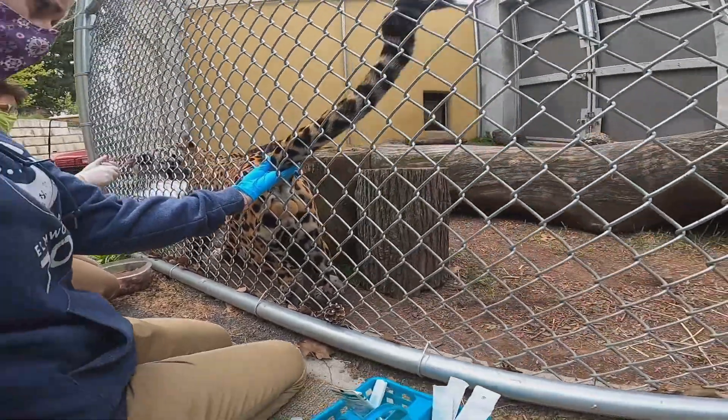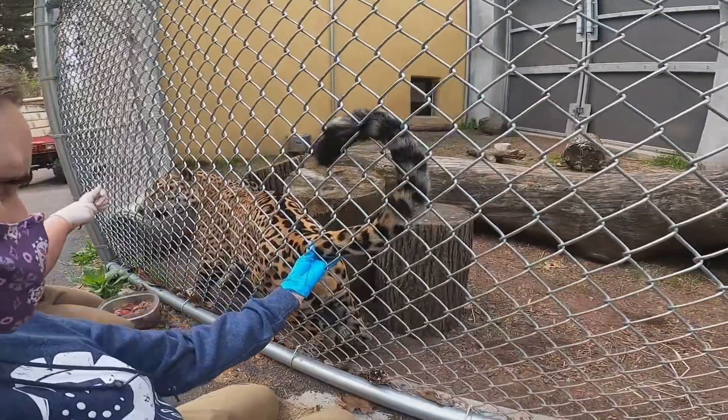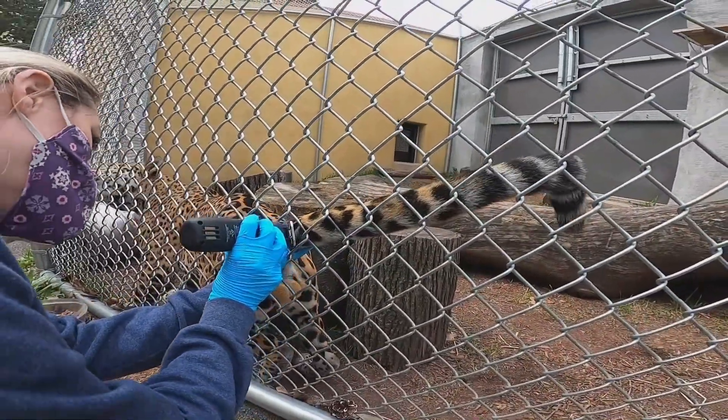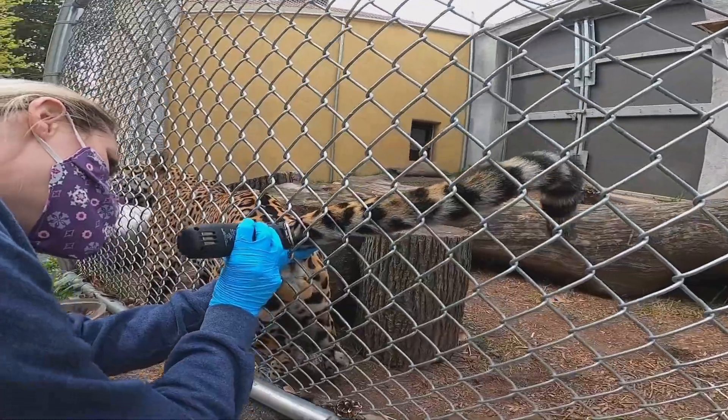You will now see Courtney use a pair of electronic clippers in order to shave a small area of fur from the side of Zian's tail.